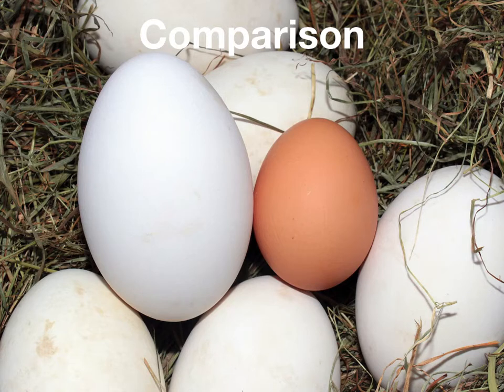You can further confirm if what you're seeing is indeed pathology by comparison to the opposite side. The beauty of musculoskeletal ultrasound is that for most scans, an internal control is always available. When scanning, whether this is for a joint effusion, a potential fracture, or a tendon injury, it's always useful to compare the abnormal side to the normal side of the patient. This will help with easier identification of what is true pathology.